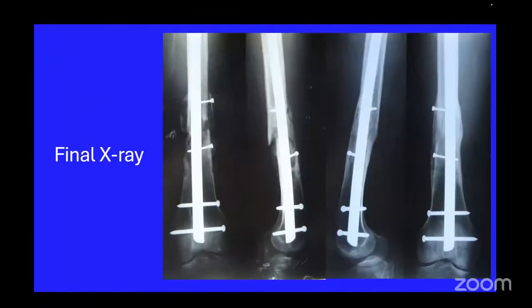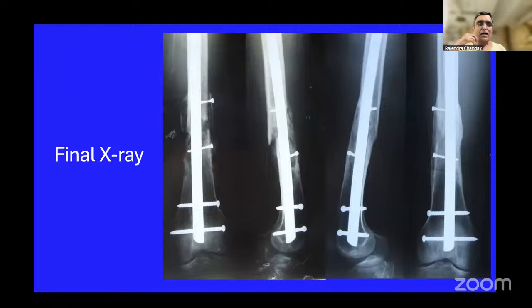So this is the final construct. After the antibiotic coated nail, the infection settled down, and then we exchanged at 6 weeks with a nailing procedure done from the proximal site itself. This is the graft which has been put at the fracture site, and that patient healed nicely over a period of time. So I'll stop share here.